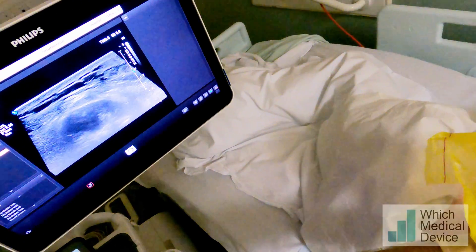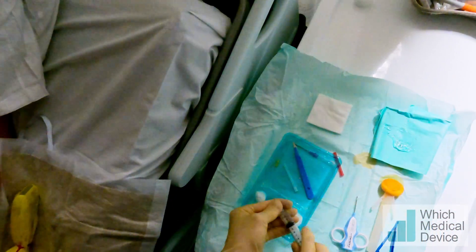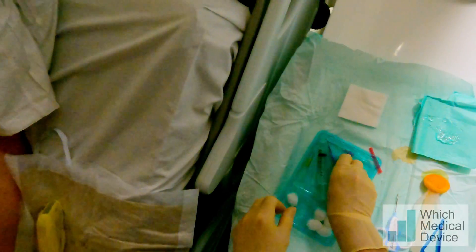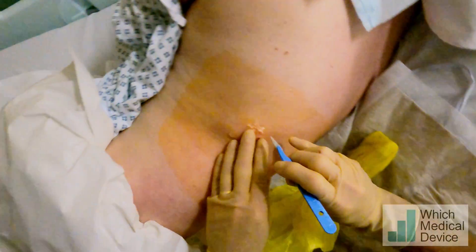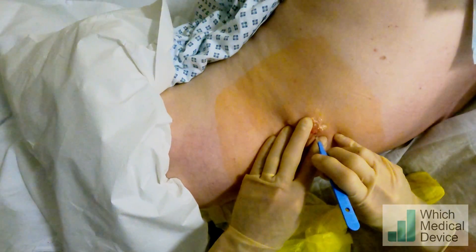We're right the way down to the lesion there with the local anaesthetic. Just coming gradually back injecting local. So that's probably the worst bit done now. Does that feel sharp? Good, a bit of pressure.